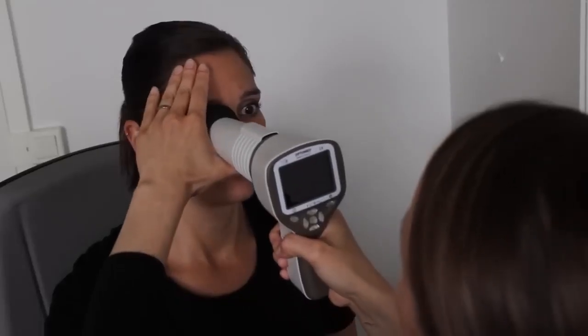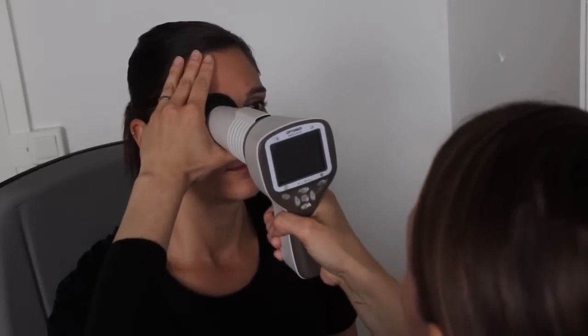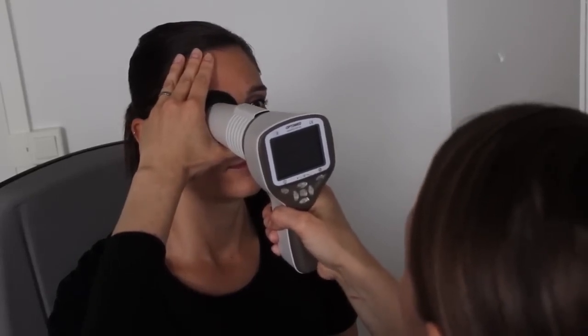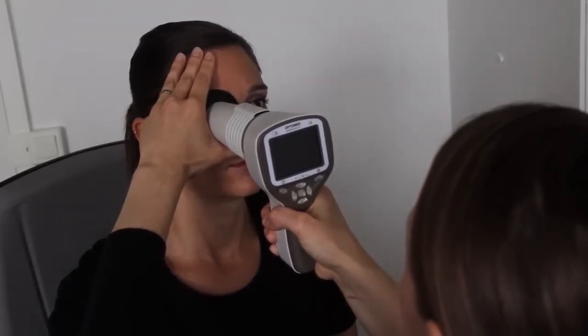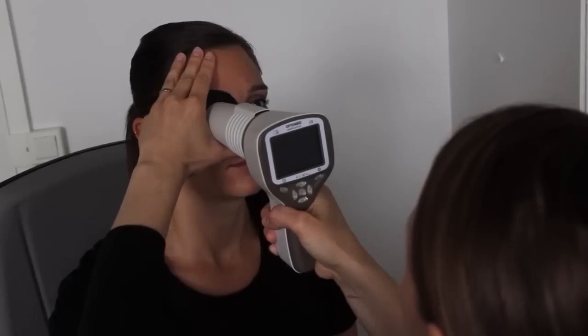Start approaching the eye from about a 10 centimeters distance. The camera should be positioned in a direct line to the center of the pupil. Keep the pupil in the center of the display and approach it until you can see the reflection from the retina which will appear as grayish with the infrared light.